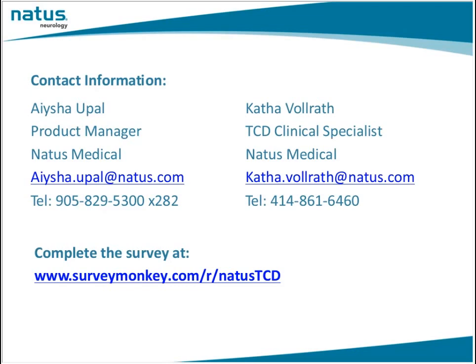No, it is not. In fact, we didn't use it at all because we found that it didn't add that much information except on the occasional patient, and the children just didn't like it. It was better to err on the side of getting a good transtemporal view than to get them all upset and crying and not be able to do that. So we decided after the original pilot study that we were not going to do the orbital approach. Makes sense.